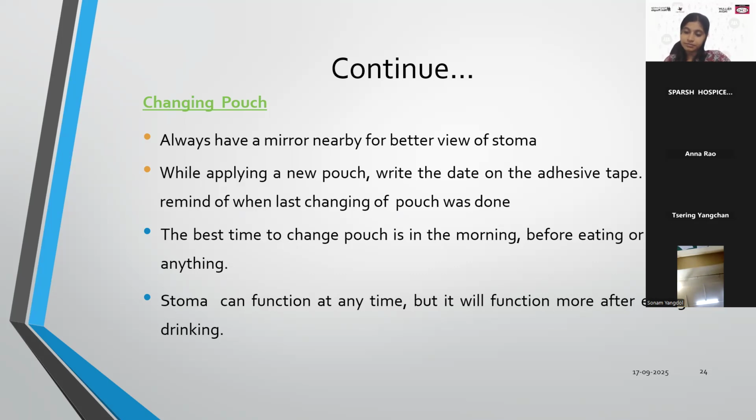In the two-piece set, the sticker is one and another is the wafer. That will be stuck, and then the colostomy bag is attached. There are clips there, you can see in the figure. So that will set perfectly on the wafer. There will be a click sound, so then it is taken that it is fixed properly. And how it will look on the patient's abdominal wall is shown in the extreme right picture.